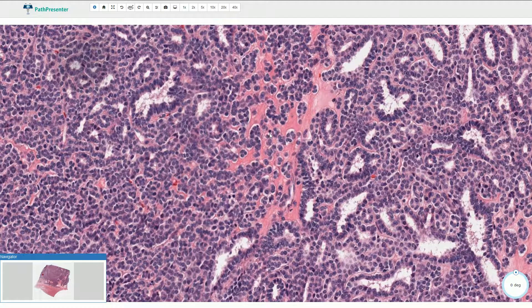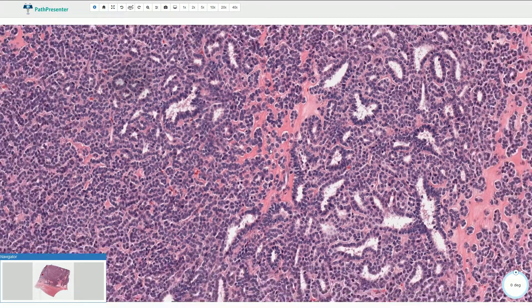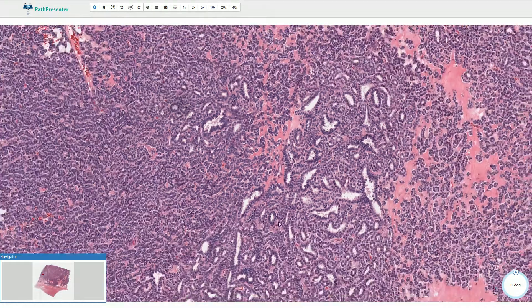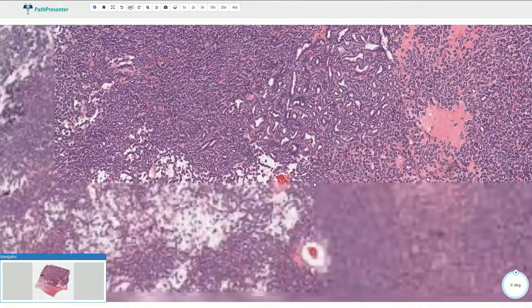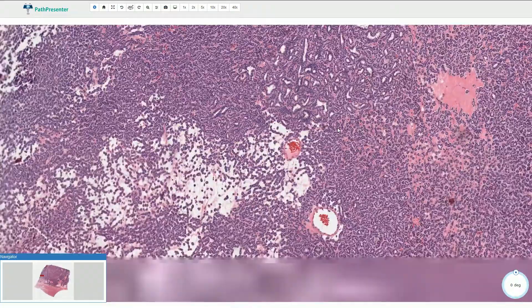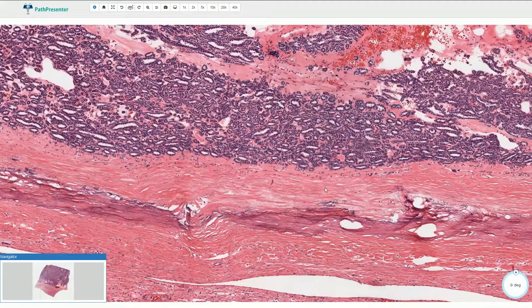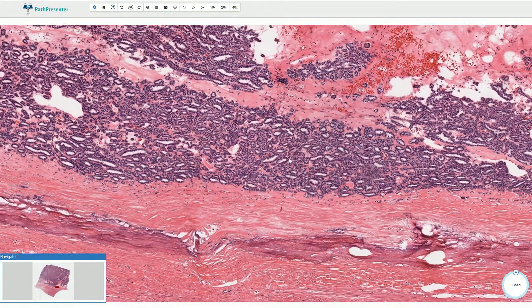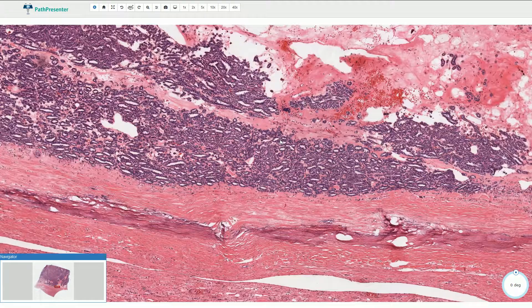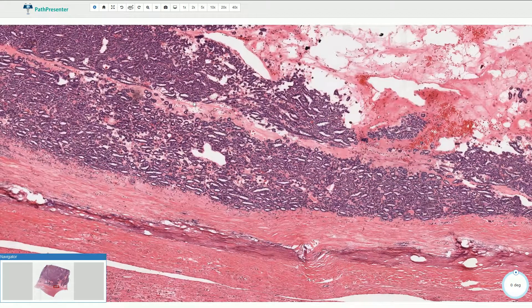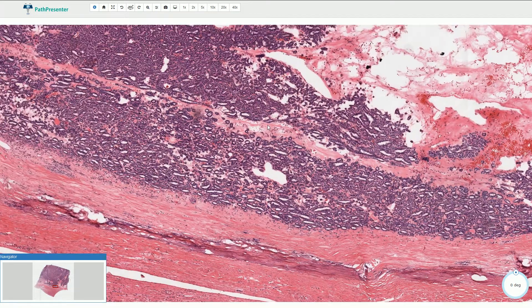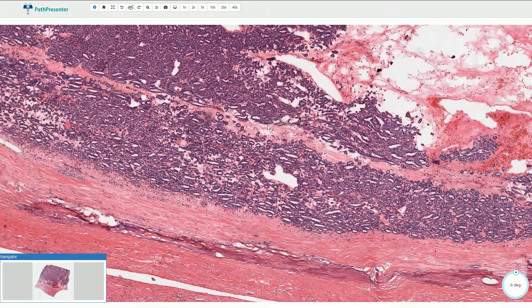The differential diagnosis includes papillary renal cell carcinoma, especially in cases with a fibrous pseudocapsule. That's what we see here, for example, but there are no papillary formations in this case, so this is clearly metanephric adenoma and not papillary carcinoma.